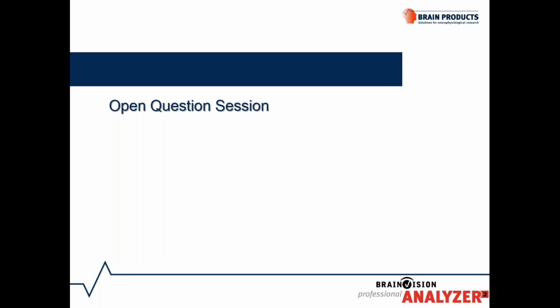So I see a few questions already came in. And one is, where exactly can I find out which data formats can be read by Analyzer?